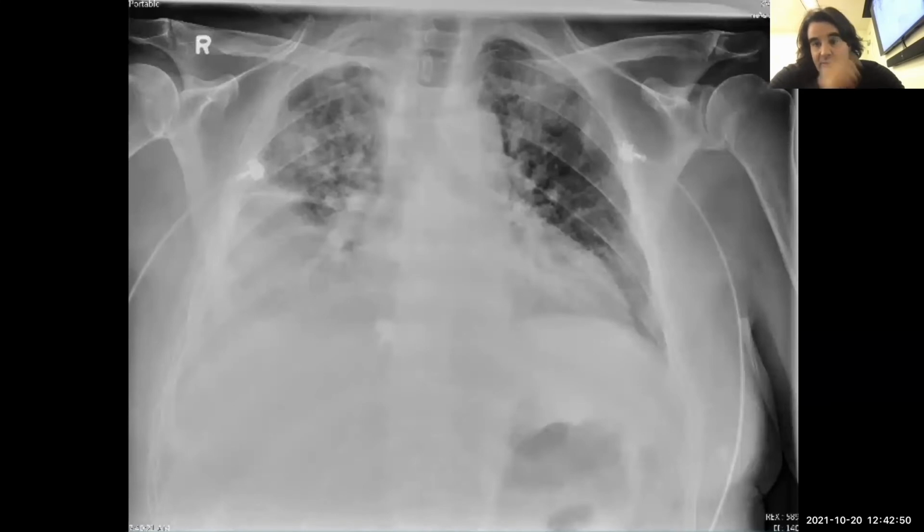Here's the chest X-ray. I must admit, I heard about this case, and so was involved from that standpoint, and I thought, let's just wait. This guy's post-transplant. In this patient population, you have to be super careful that you aren't poking the side of this new transplanted organ, and there are a number of other reasons to be super cautious, which I'll get to.